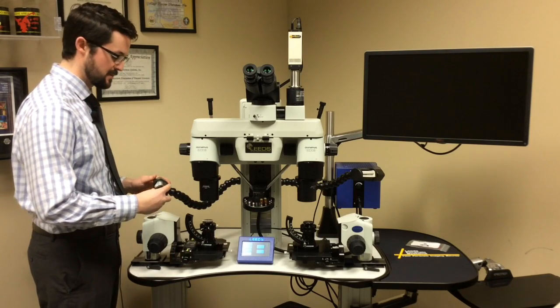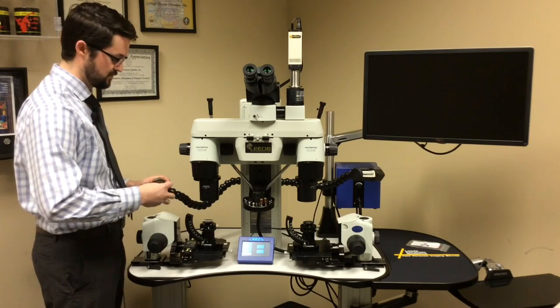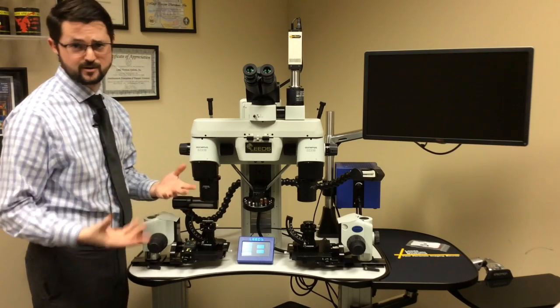And again, it's the same idea — you just press it in. Make sure you have full range of motion. And then at this point, I would replace the light bulb on the other side of the microscope as well.